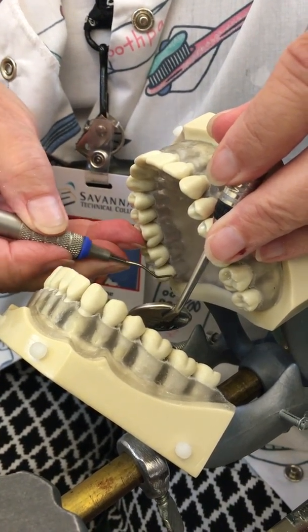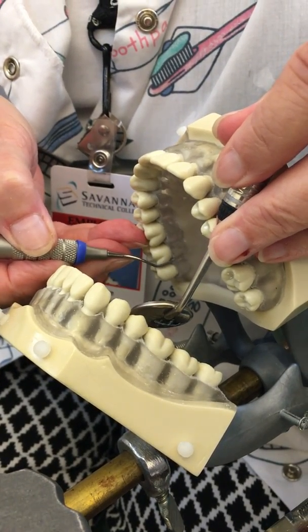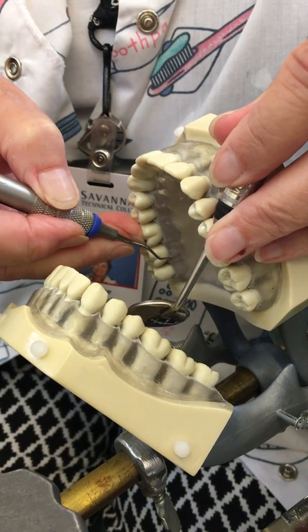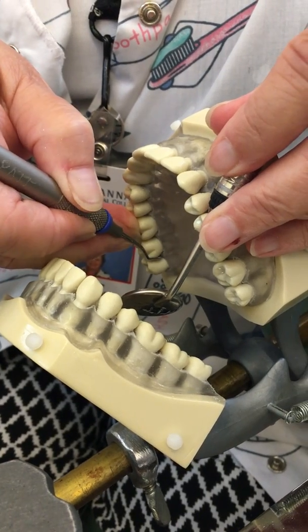When I finish I'm just going to remove my instrument, go to the next tooth distally, going closed and open. Remember we start at the distal line angle, go around that corner, and then across the distal surface.